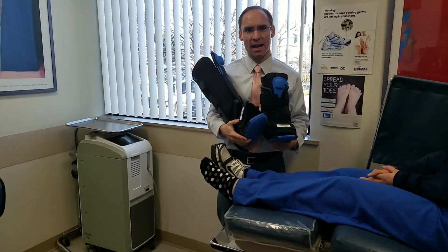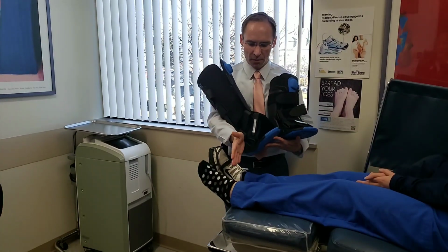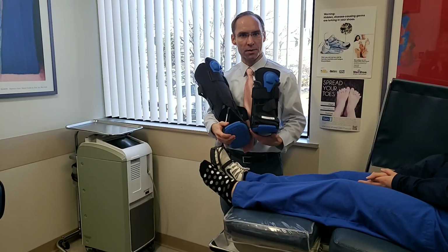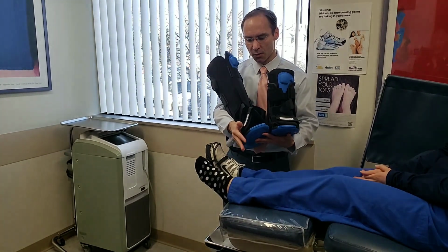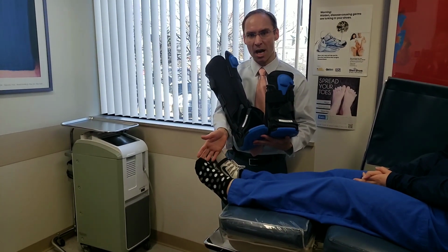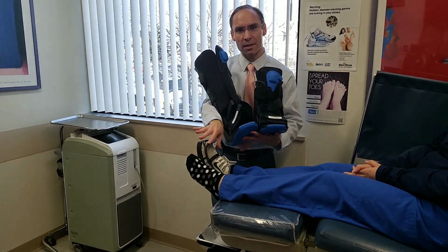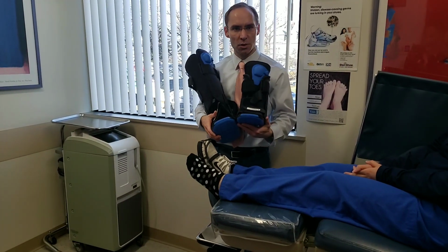So if someone has an area that's inflamed on the foot, more on the bottom of the foot, kind of up to the ankle area, then I use one of these short ones. So for example, if you have plantar fasciitis, pain in the bottom or on the front of the foot, metatarsalgia, a lot of different conditions that just aren't getting better and haven't got better with a cortisone injection, then you would use this short one.